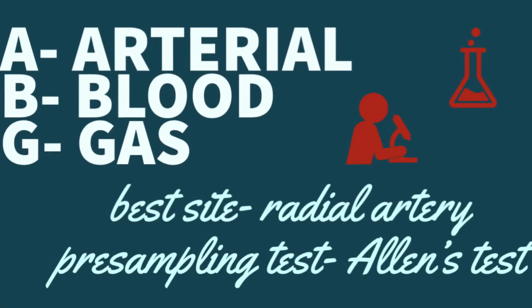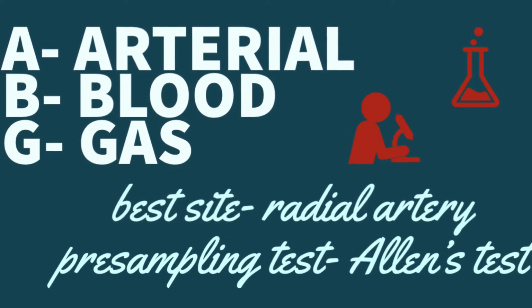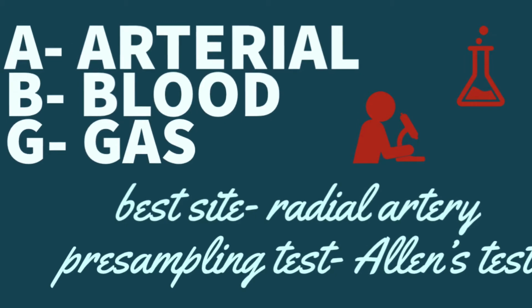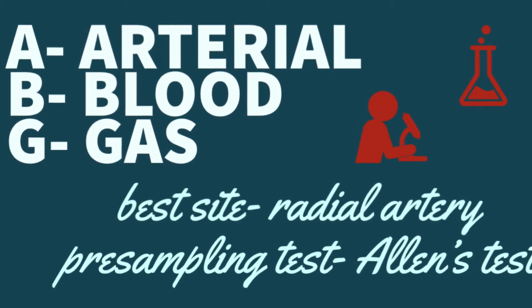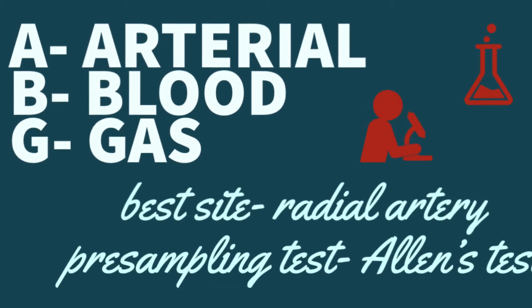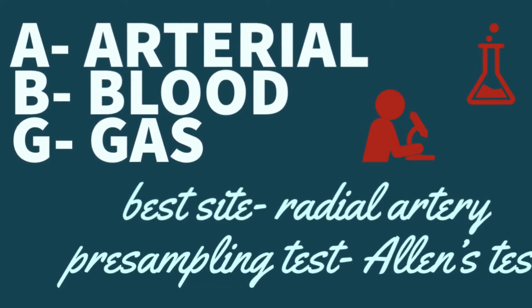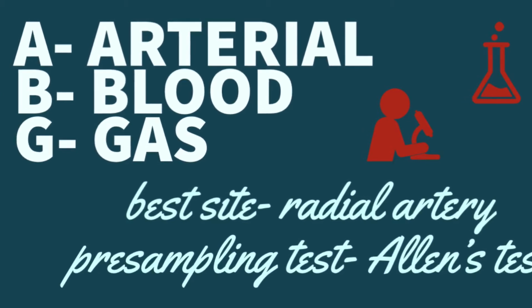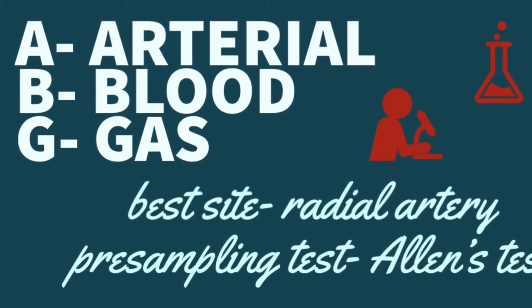Best site to perform the ABG test is the radial artery, and the pre-sampling test is Allen's test. It is performed to know the adequacy of the radial and ulnar arteries. Apply direct pressure to the radial or ulnar artery, release the pressure, and assess the color of the extremity to the distal point, and assess whether the color is returning within 6 to 7 seconds.